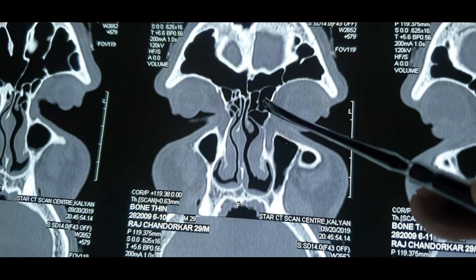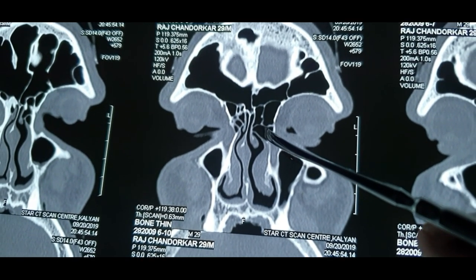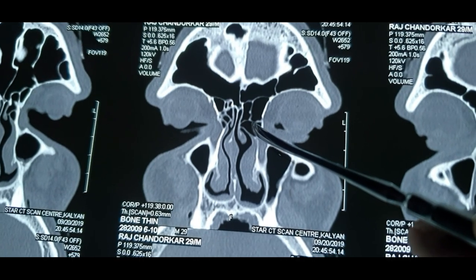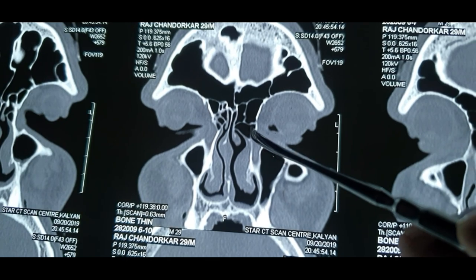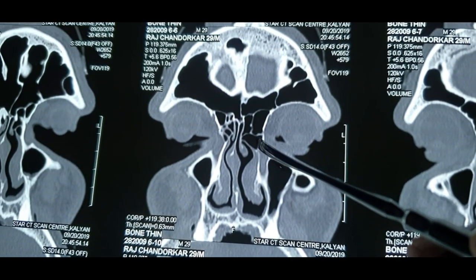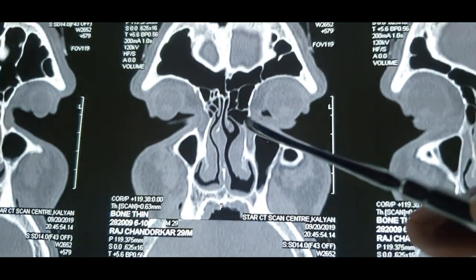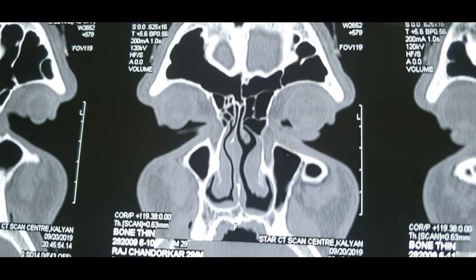As I was saying, the frontal recess is anteriorly bound by the agger nasi. And what actually is the agger nasi? It is nothing but an anterior ethmoidal cell which pneumatizes the lacrimal bone. So if the agger nasi is too big or too pneumatized, it can pneumatize the entire lacrimal bone, which makes it very necessary to open while performing endoscopic DCR, dacryocystorhinostomy.